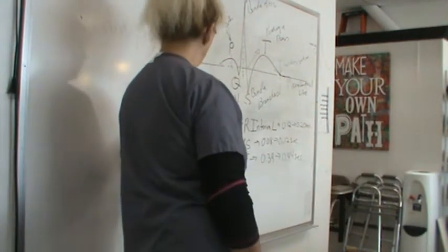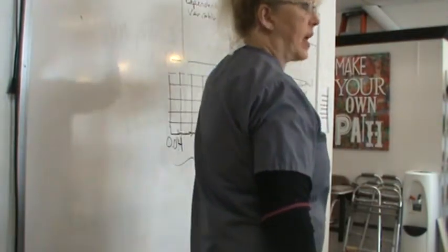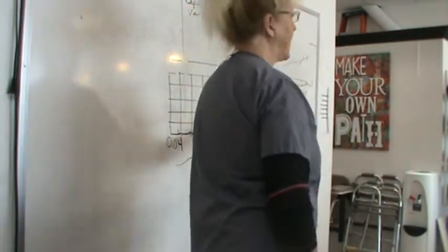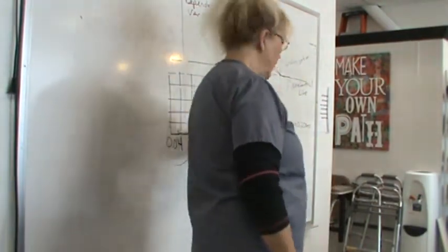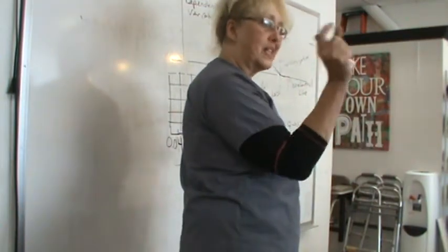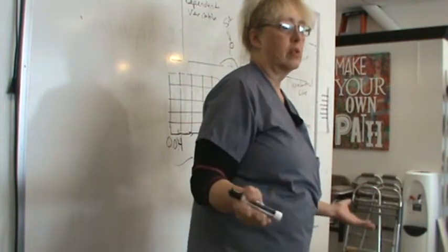So 0.1, 0.2, 0.3, 0.4, 0.5, etc. Each of these boxes are stacked on a piece of paper. The heart rate is translated onto the grid, and because we know the distance of each of the grid squares, we can measure the horizontals.